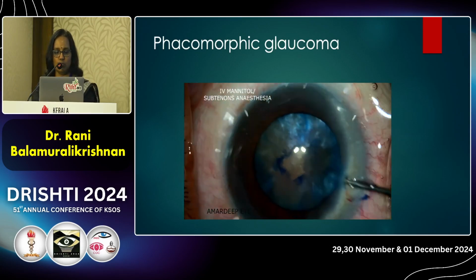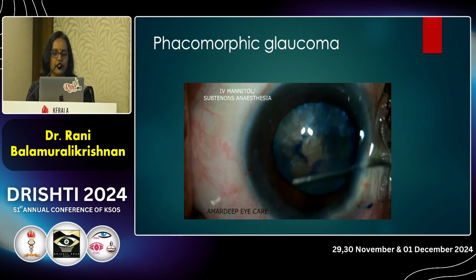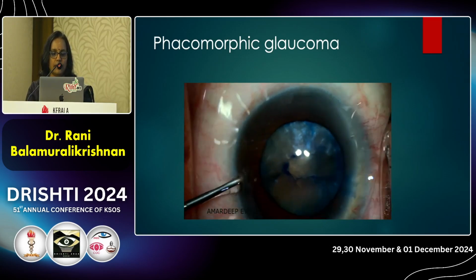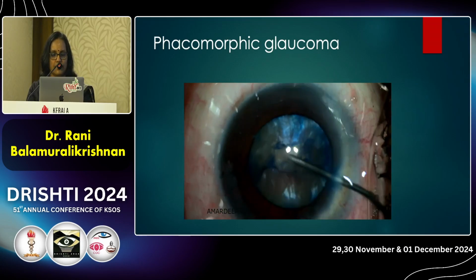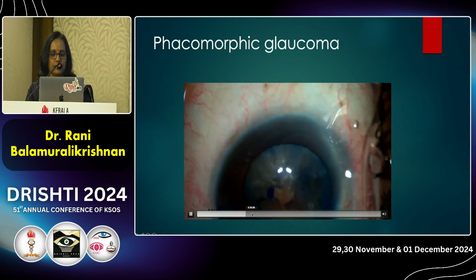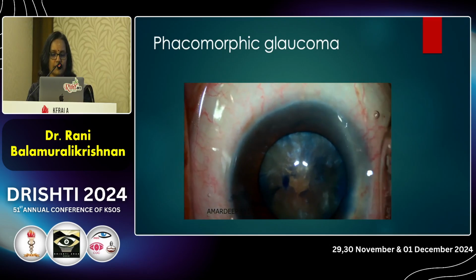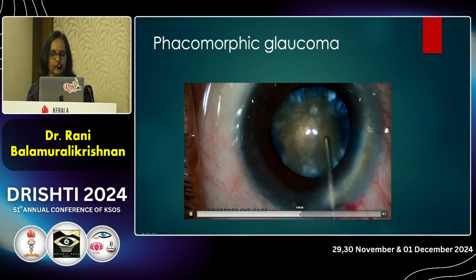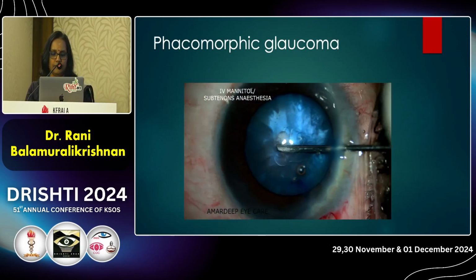The lens is too tense, the capsule. You can make multiple punctures in the anterior capsule and let out the material inside the capsule to reduce the intracapsular tension. You can aspirate the content as well as massage it out. Now you can easily conduct the capsulorhexis without the fear of an extending or Argentinian flag sign. You can complete the phacoemulsification. As you see, the capsulotomy is very easily performed and phacoemulsification is completed.